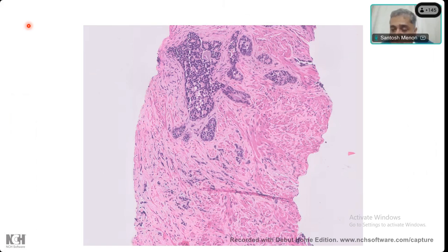So Apurva, you are asking about the atrophic subtype of prostate cancer. They will look like atrophic glands, so unless you do a basal marker, you will not generally be able to diagnose them. Something like this, a very small gland that you think is atrophic, blue looking and mimics an atrophic gland, but does not have basal markers, especially in a non-treated setting, you would probably diagnose that. It's not very common. I don't see atrophic prostate cancer very often. Verma sir, do you diagnose atrophic prostate cancer commonly?